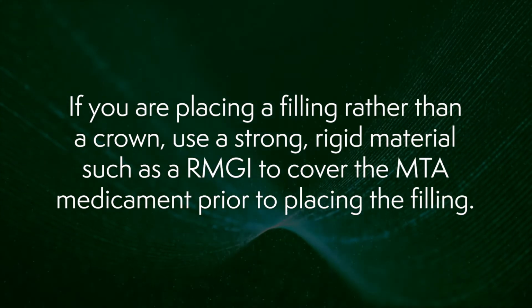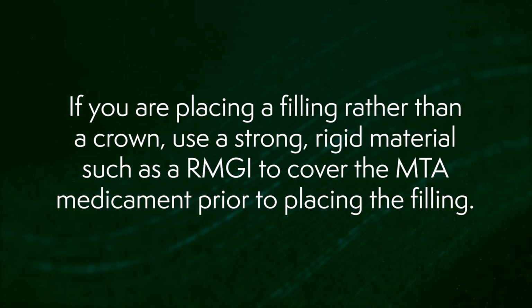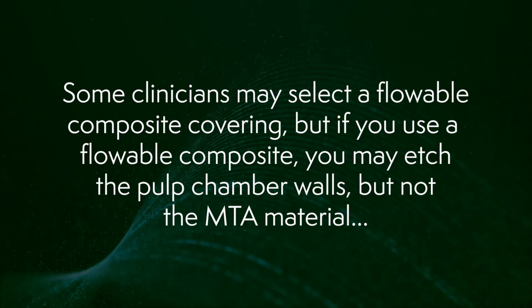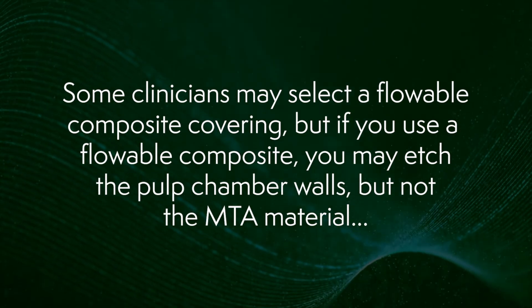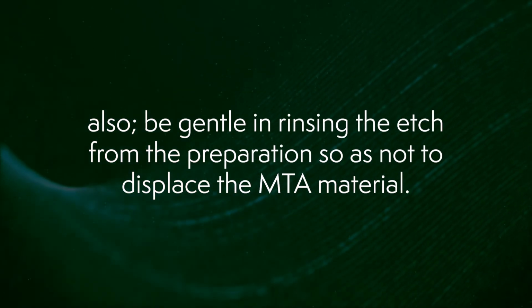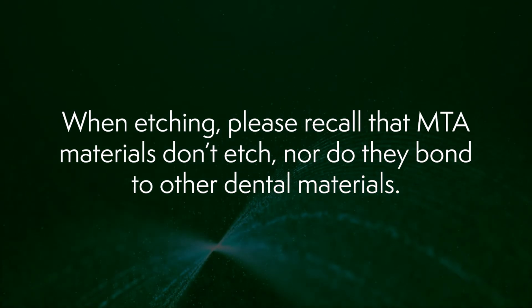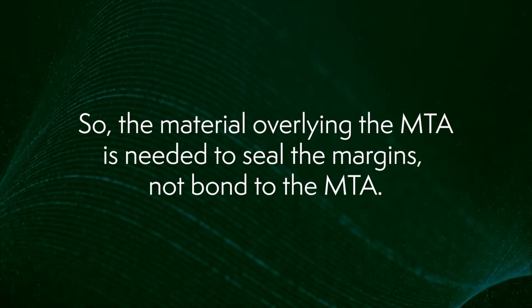Also remember, if you're placing a filling rather than a crown, use a strong, rigid material such as a resin-modified glass ionomer to cover the MTA medicament prior to placing the final filling. Resin-modified glass ionomers are light cured, they bond to the dentin, and they have a good compressive strength. Some clinicians may select a flowable composite covering, but if you use a flowable composite, you may etch the pulp chamber walls, but not the MTA material. And also, be gentle in rinsing the etch from the preparation so as not to displace the MTA material. When you're etching, please remember that MTA materials don't etch, nor do they bond to other dental materials. So the material overlying the MTA is needed to seal the margins, not bond to the MTA.